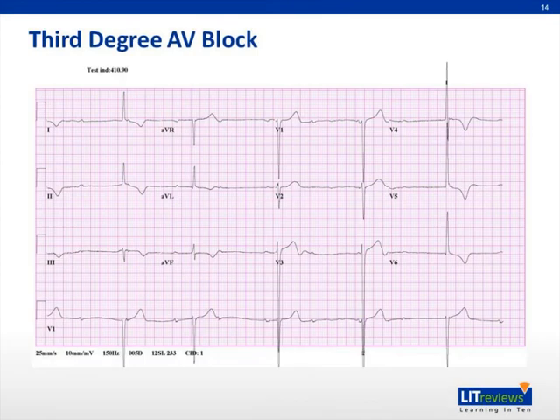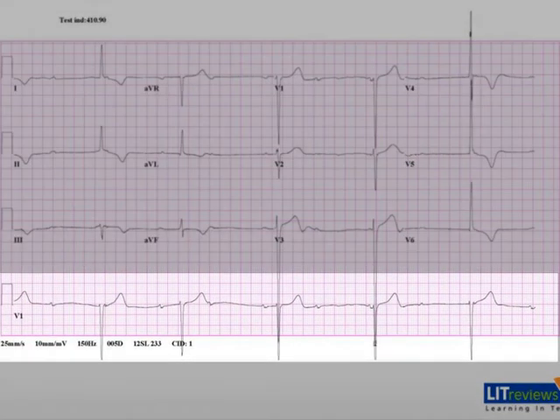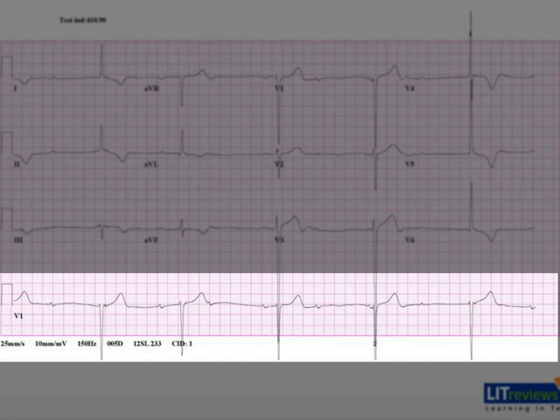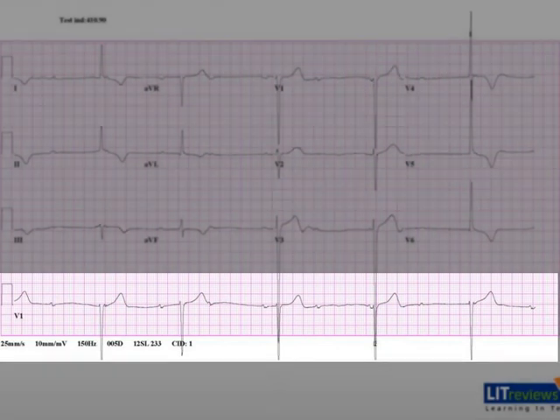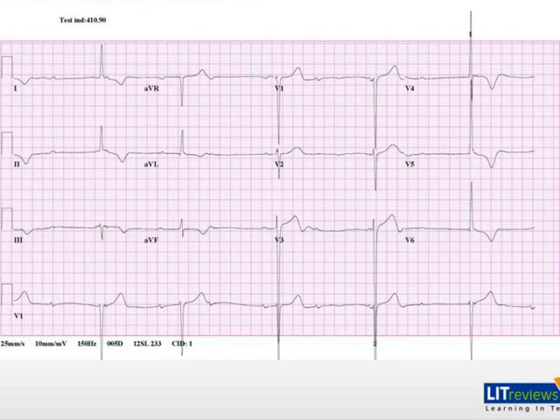This 12-lead ECG demonstrates third-degree atrioventricular block. Looking at lead V1, there is clear dissociation of the P waves and QRS complex. The atrial rate is around 60 beats per minute, while the ventricular rate is around 33 beats per minute. The P wave is completely buried in the first and fifth QRS complex, confirming atrioventricular dissociation.